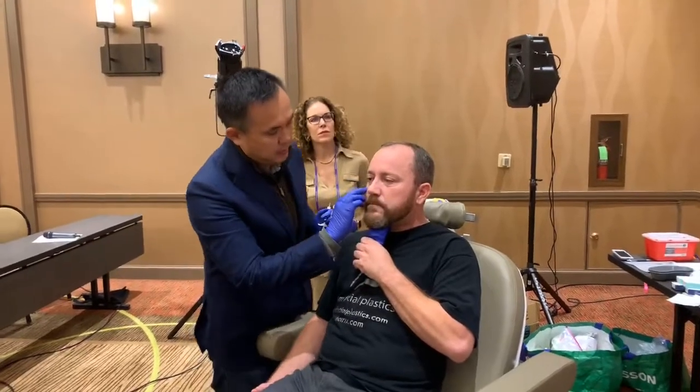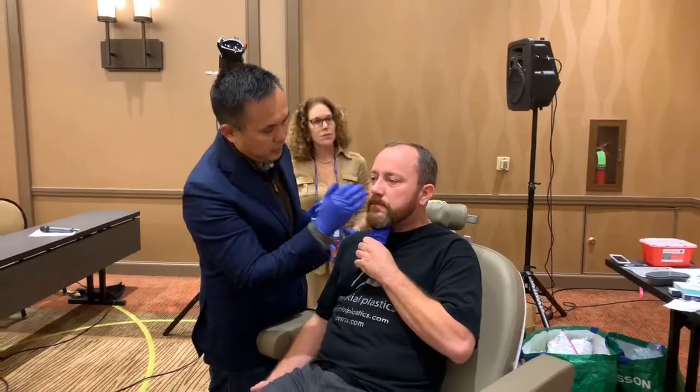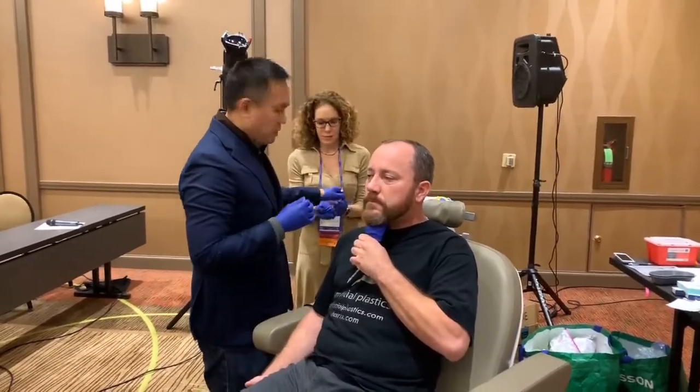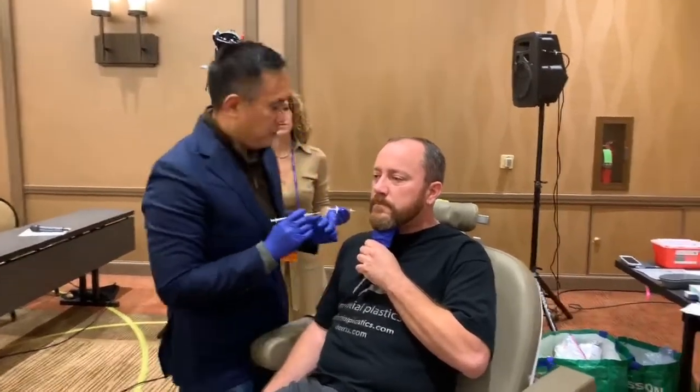In the medial aspect, he's got a little bit of ptosis on the left eyelid, and the concern I have with a little Botox up there is always the potential for releasing that ptosis, but we're just going to put a little bit up there for him.